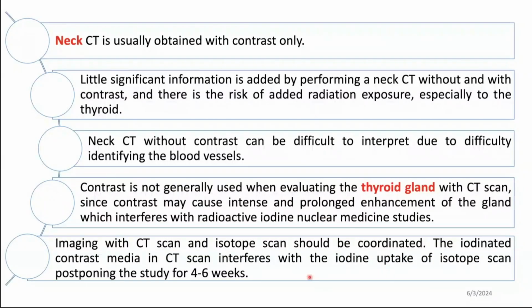So if the patient is coming in with 2 appointments, one for thyroid scintigraphy, the thyroid nuclear medicine scan, and one for CT of the neck with intravenous contrast, we have 2 options.